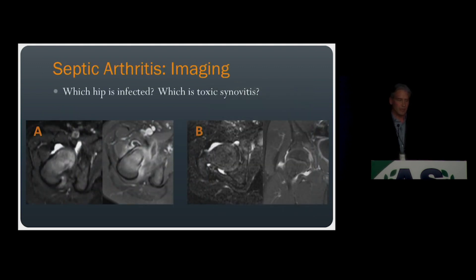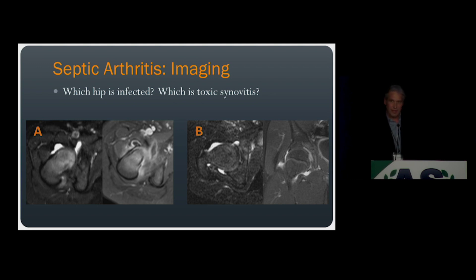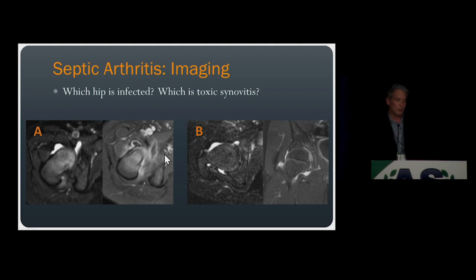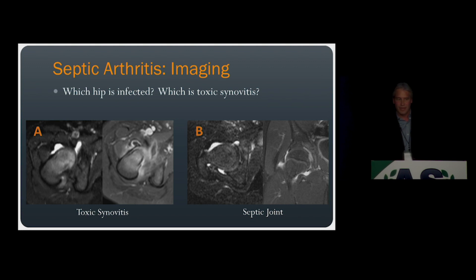Now let's move on to septic arthritis with a little quiz. Two patients present with a right hip joint effusion — one has septic arthritis, the other has a reactive joint effusion from toxic synovitis. They look very similar. Both have a moderate hip joint effusion. Patient A has a little soft tissue inflammation around the hip joint; patient B does not have periarticular inflammation. Patient A's marrow looks a little increased, but that's just residual red marrow. Patient A had benign toxic synovitis, while patient B had septic arthritis, even though their only finding was a joint effusion.